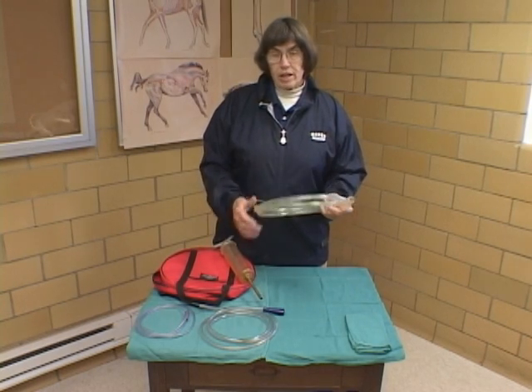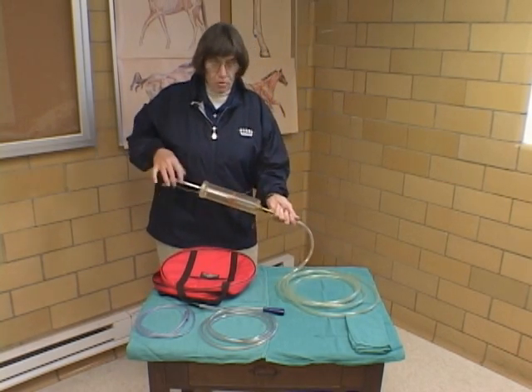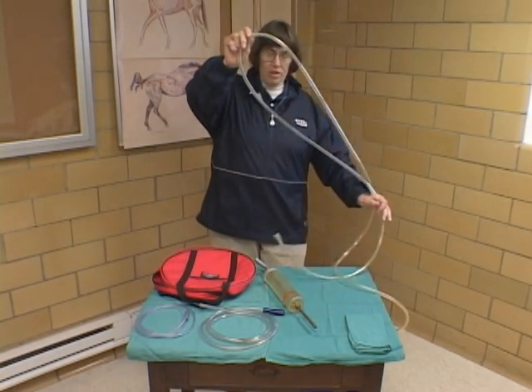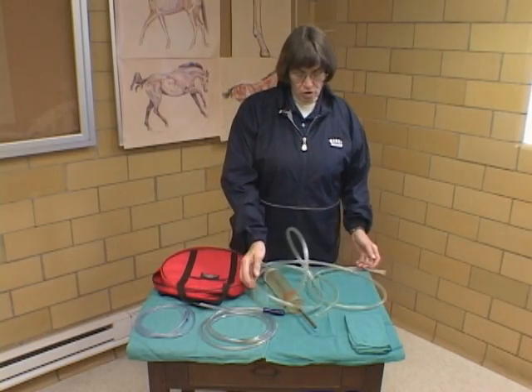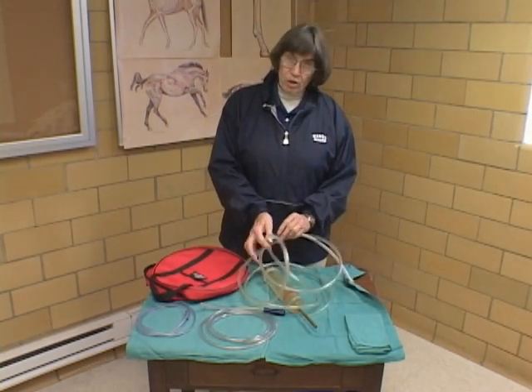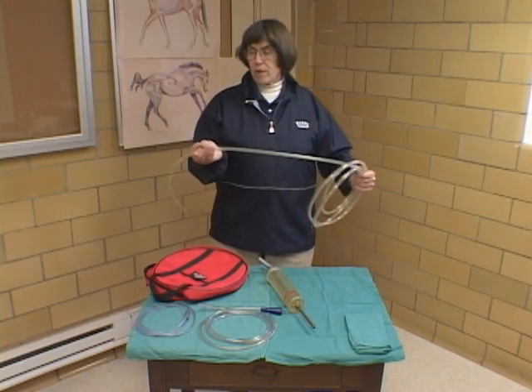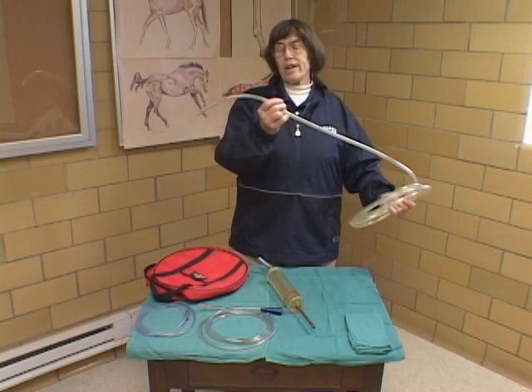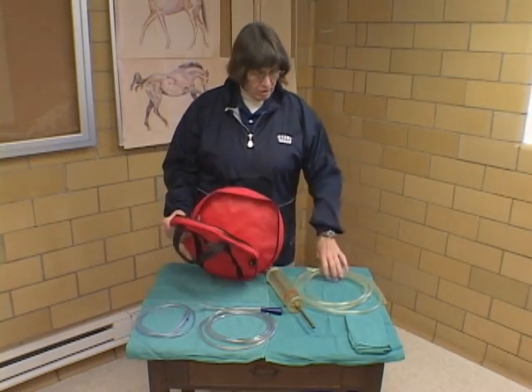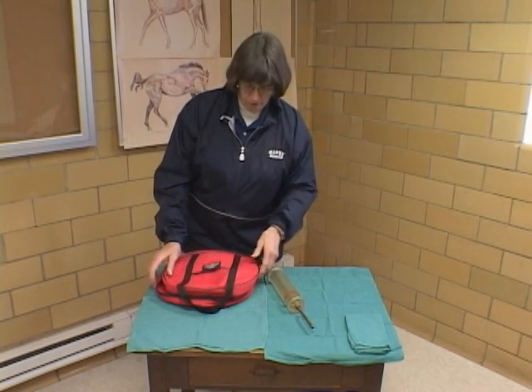When we are finished with them, they get cleaned. We use a soapy solution — we would flush a soapy solution through them and rinse them well. We like to then hang the tube up somewhere so it can dry. When we store it in our car or the hospital, we like to keep it in a coil. This coil helps us a lot when we pass the tube, because we want to pass it into the ventral meatus and keep it staying down there. We keep our tubes in a case in the car so they stay protected and keep that coil.